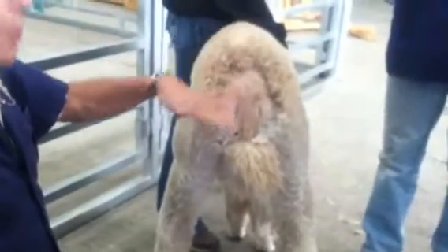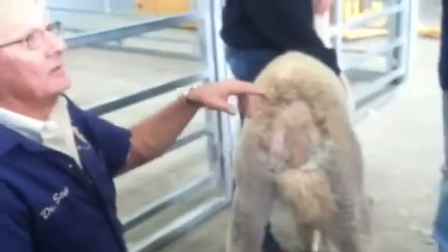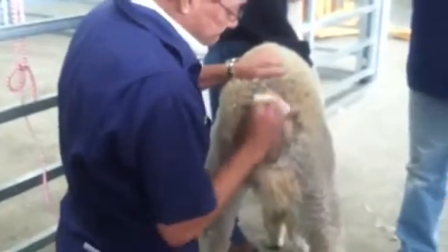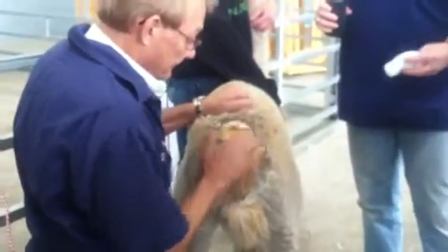Actually, in real life, what you want to do is wash it off, because I'm going to guarantee you, this animal is not going to stand there in real life. And of course, you've got to clean all the uterine material off. You should never put that back in there — that's a no-no.